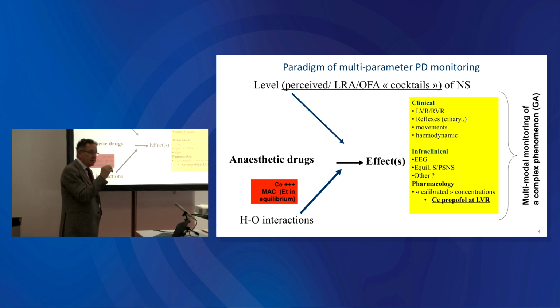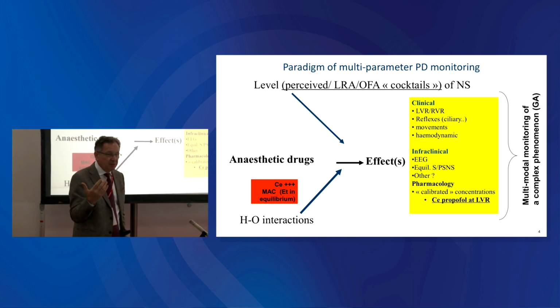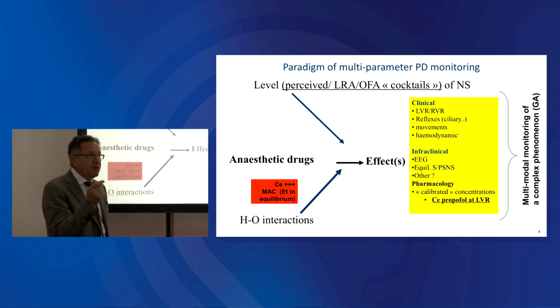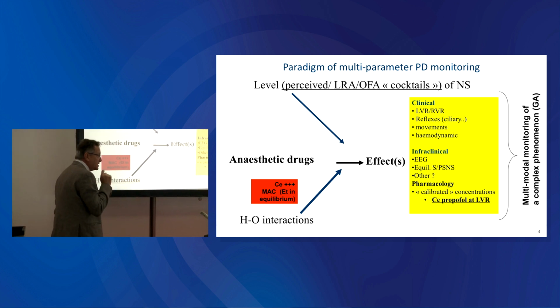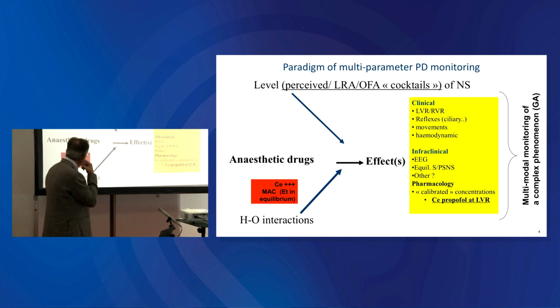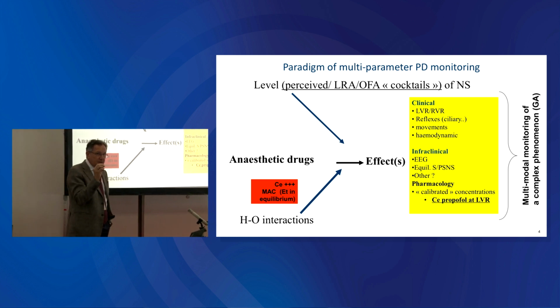So the drugs, there's a divide between Europe and the United States because TCI is not accepted and not FDA approved in the United States, but in Europe TCI is approved. So using TCI actually facilitates, because it is much easier to think TCI than dose. If you want to titrate, it is much easier to think concentration at the effect site than the dose.